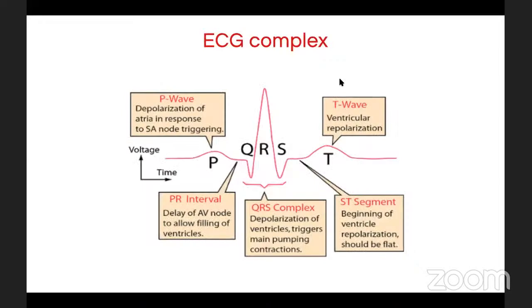أوكي الحين راح أتكلم عن ال ECG complex. أوكي الحين عندنا أول شيء ال P wave. طيب ال P wave هذه represents ال depolarization of the atria. أوكي عندنا الاتريا صار فيها depolarization يعني نعرف منها إنه صار في contraction في الهارت. أوكي طيب بعدين ال PR interval هذا represents the AV node delay. أوكي زي ما شرحتها قبل شوي حنان. أوكي يعني نعرف من ال PR interval إنه صار الحين في delay of the AV node صار في conduction حق AV node. طيب ال QRS complex represents ال depolarization of the ventricle يعني إذا صار في contraction في ال ventricle راح يطلع لنا هذا ال QRS complex.